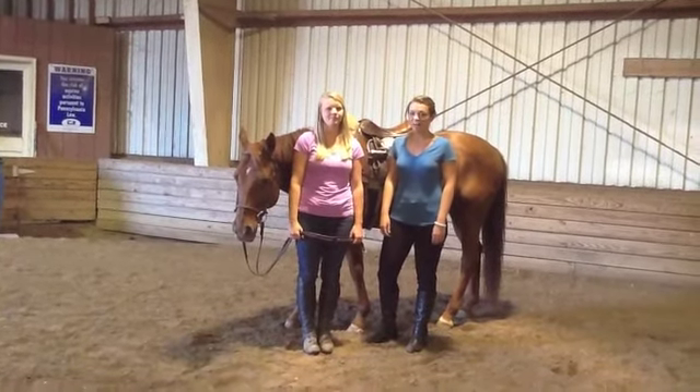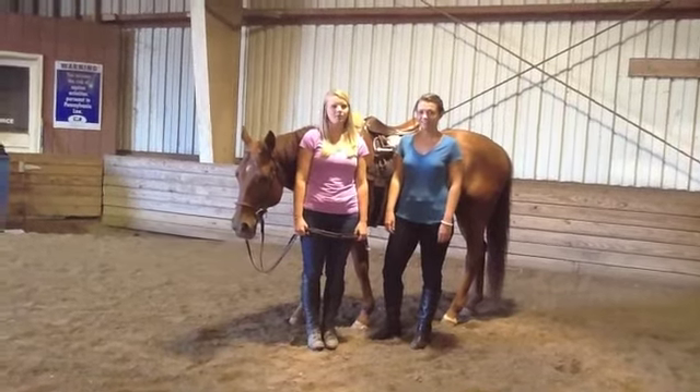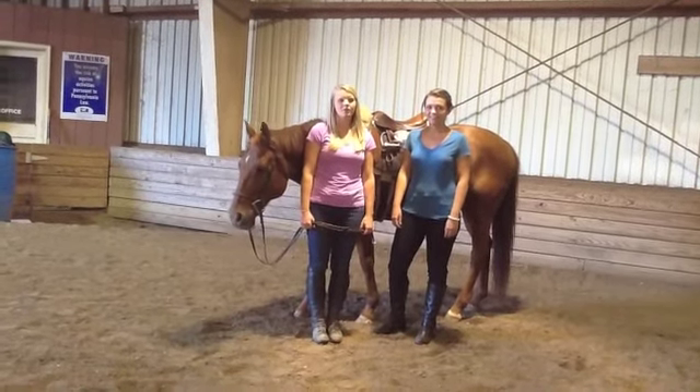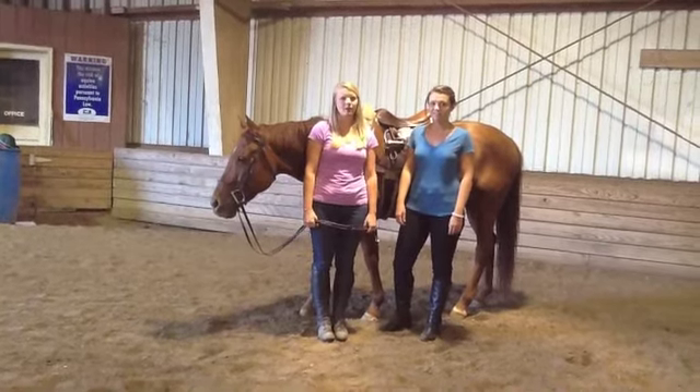Hi, I'm Megan Fleming. And I'm Casey McKay. We're from Temple University's Occupational Therapy Program. Today we're going to show you how to use ladder reins, an adaptive device used in horseback riding.